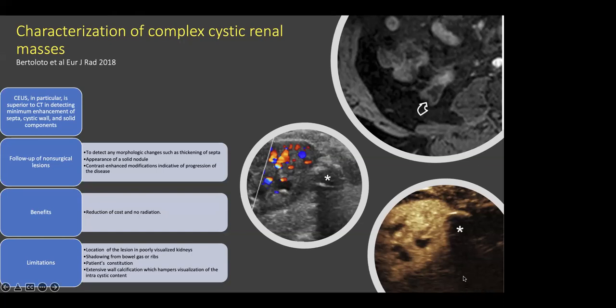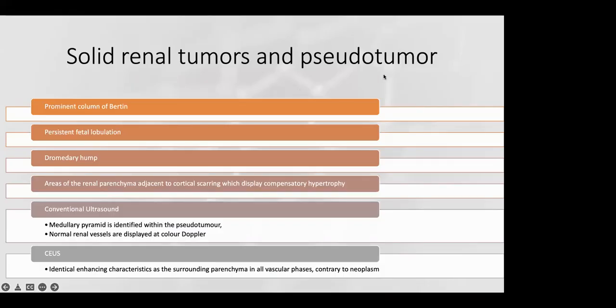With the patient's respiratory movement, if the area is really small, like we are seeing in a few of the cases that you have just shown, keeping that area focused in the center of the screen is sometimes challenging and requires a lot of cooperation from the patient.